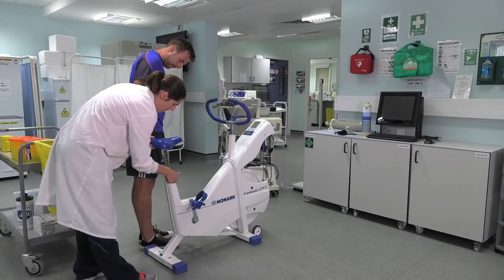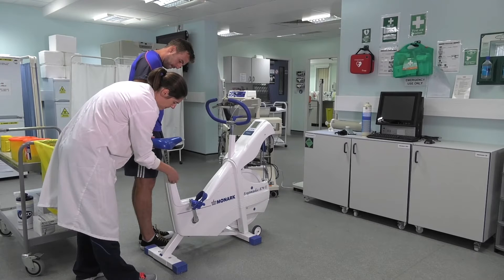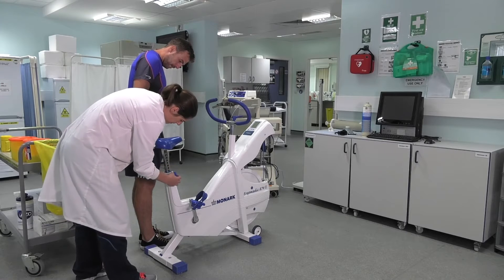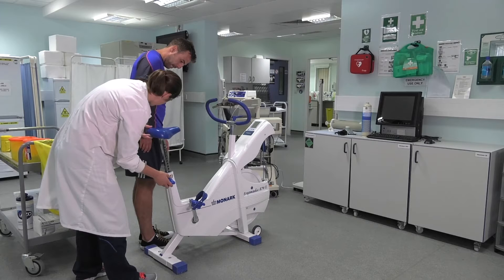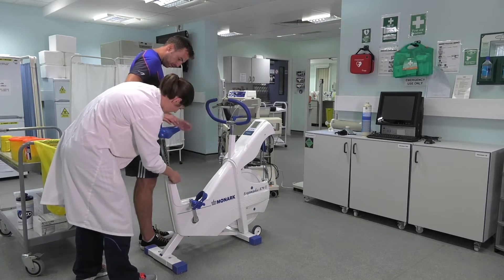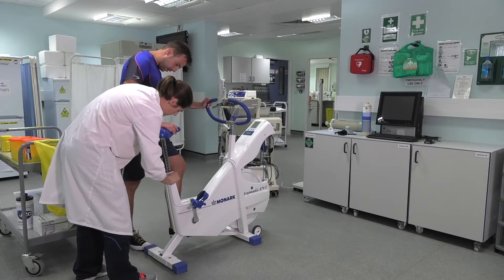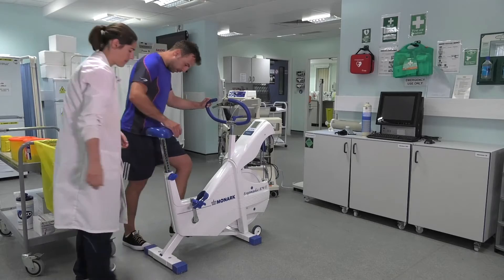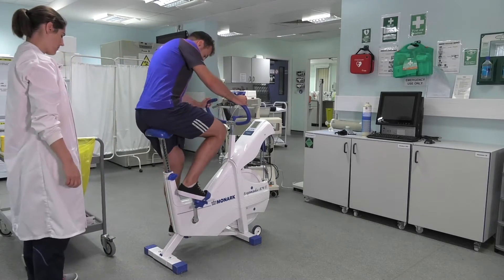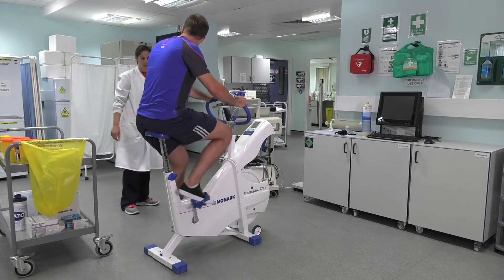We then need to set up the height of the cycle ergometer — the height of the seat. We generally say that we put the seat to where the hip is, so when they're on the bike there's a slight flex in the knee. You can see here, when the participant gets on the bike, they check the height and there's just that slight flex in the knee.